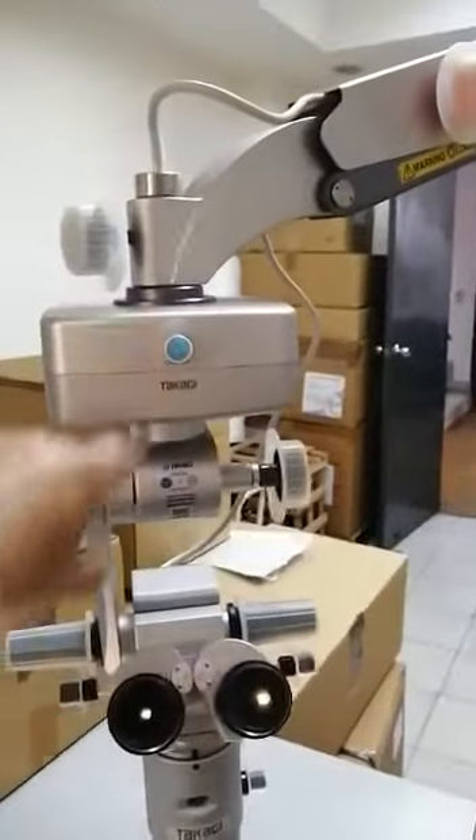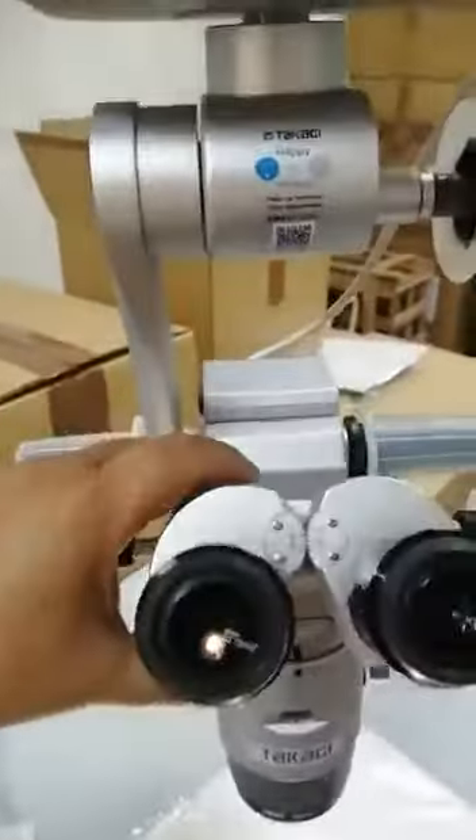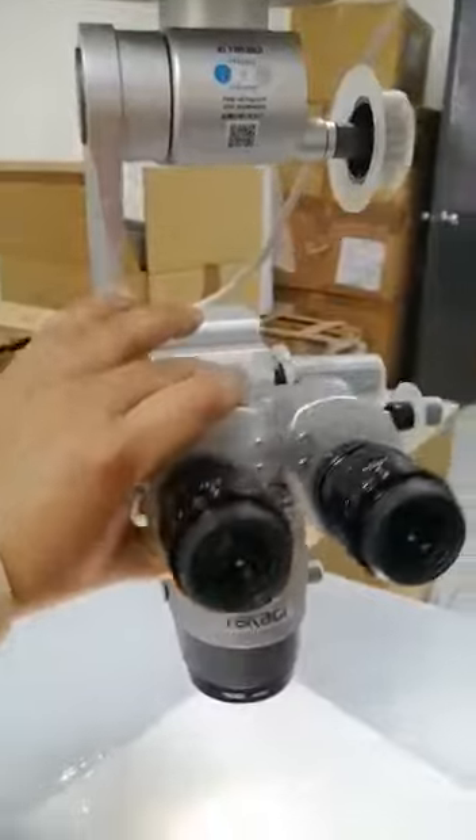This is the centering switch for XY coupling. This is the tiltable binocular — the binocular can be tilted like this.